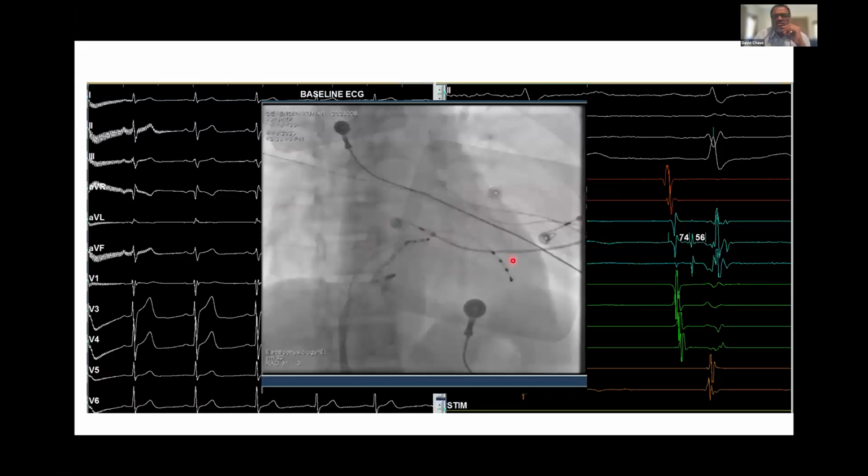The next catheter should cross across the AV plane into the RV. This catheter has shot across from right to left through the coronary sinus towards the other side. And this catheter is somewhere lower down, probably close to the right side annulus.